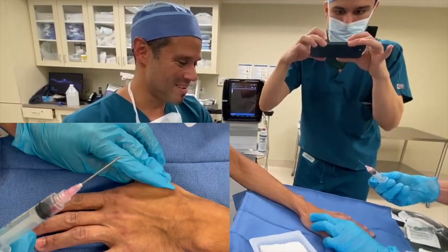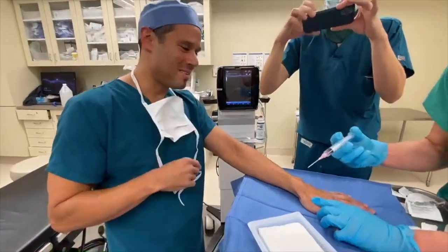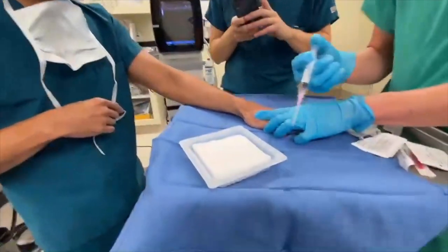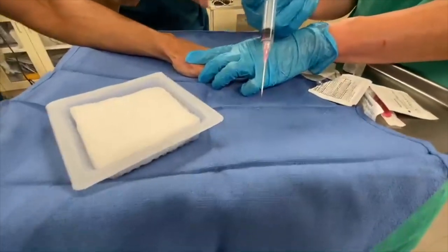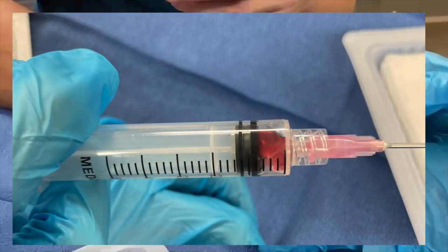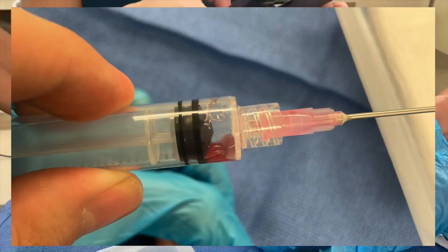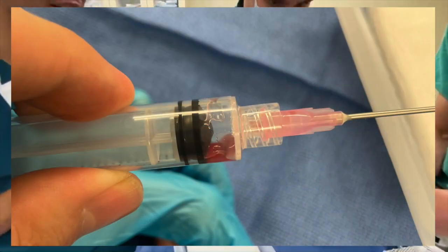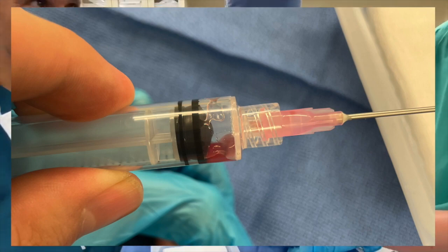That's it? That's it! You want to see what's inside it? Can we take a picture of it? Let me get a photo. But it will most likely come back again, right? 50% chance it's going to come back.